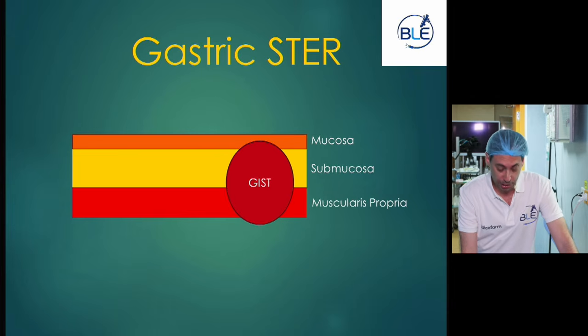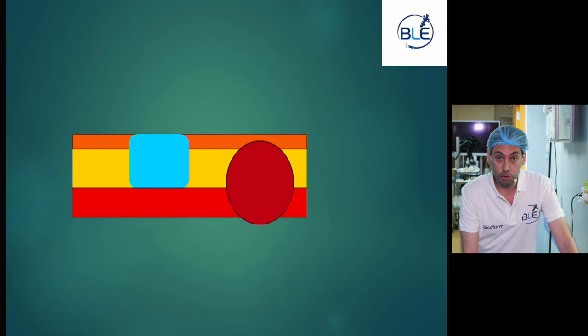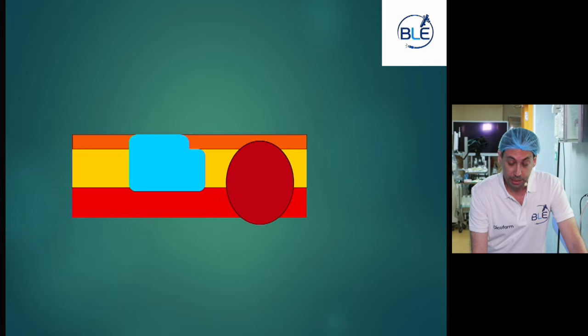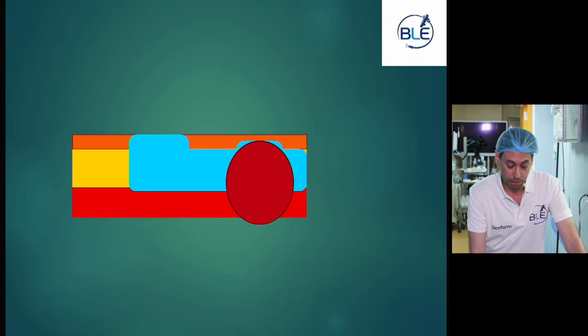So here you see our animation, and the plan is to make an incision at the mucosa in order to access the submucosal space. Then we will prolong the submucosal tunnel towards the lesion, and then the difficult part will be to go above the lesion, and the most difficult part to go below the lesion, so the access will be challenging.